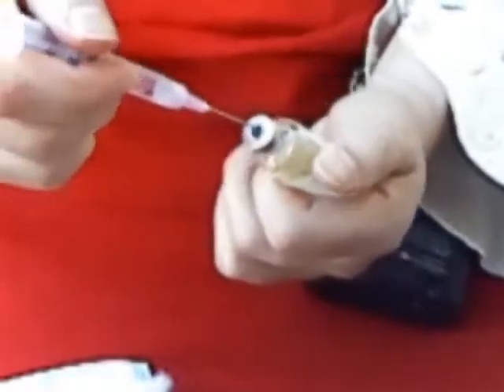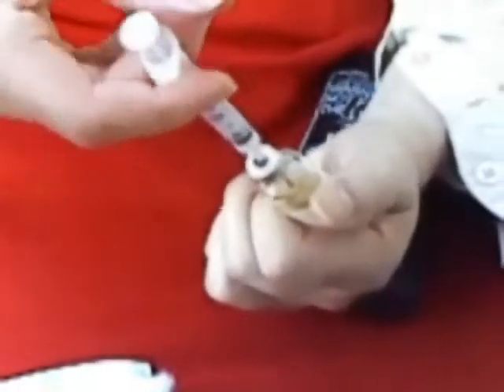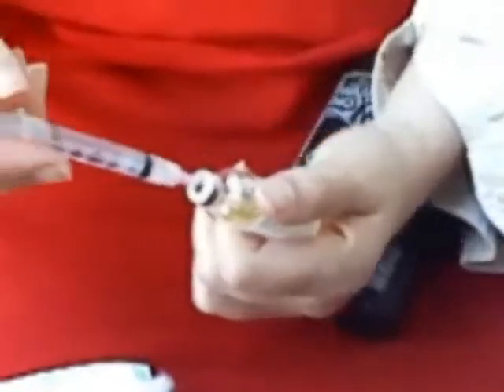Here's the bottle — I've already wiped it off. I'm going to put the needle in and inject air into the bottle. Make sure that the needle is in far enough that it actually reaches the fluid. As you inject, of course, there's going to be less and less hormone in the bottle.